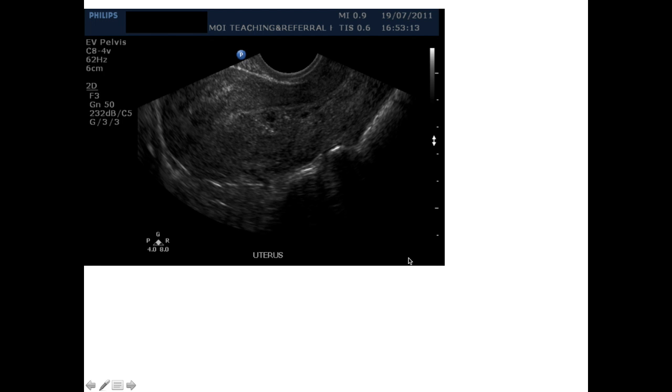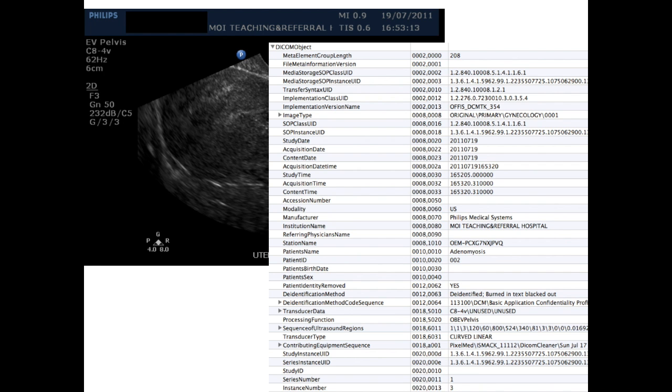When it comes to a medical image, the metadata that you're going to have is going to include things like when the study was acquired, what time it was when this image was taken, like we've talked about a couple of times, the accession number that ties a study together, what the institution name was where something was acquired, the patient's name, the patient's ID, the patient's birth date, the patient's sex, all of those basic demographic bits of information.